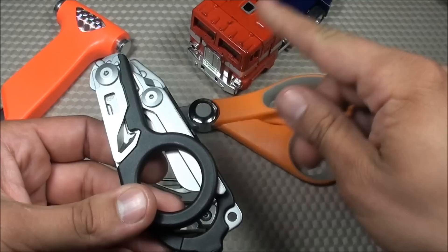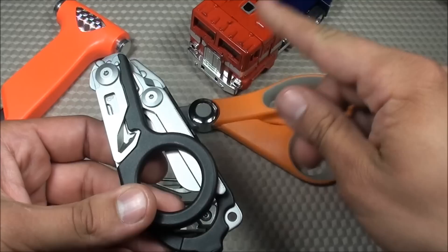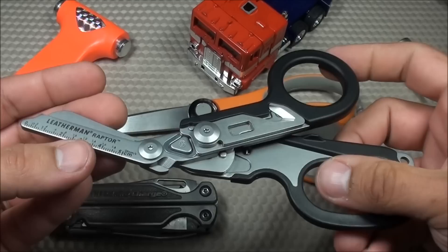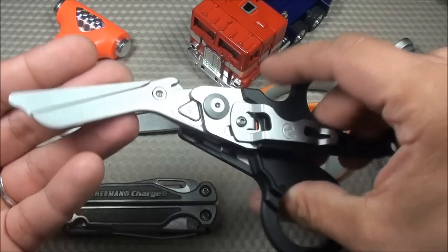And why do I say that it's a transformer? Well, it transforms with sound effects. These things were originally designed as an emergency tool for special operation medics, but they could also be very useful for EMS, fire department, first responders, military, preppers, law enforcement, and tactical guys. These things have a lot of functionality to them.